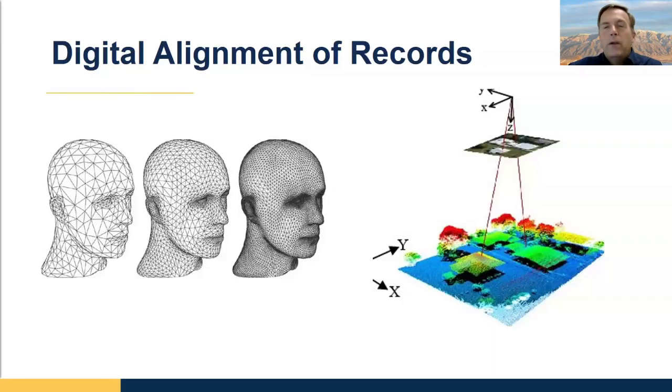So you're like, why do I care about this? The reason you care about this is you want to make sure when you're doing a series of scans for your laboratory, or for yourself for that matter, that you're creating enough common points between scans that need to be related to each other so that your files can be aligned. Now, one of the interesting things about this is, what does it affect?